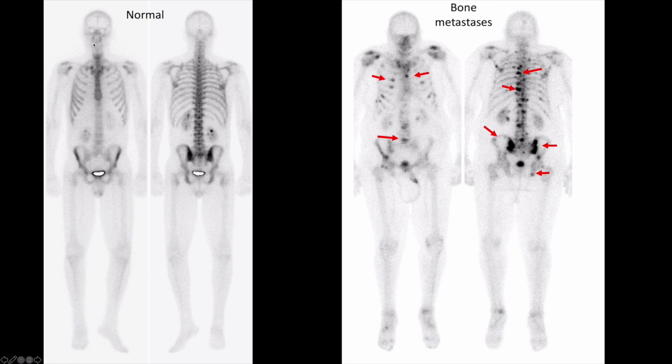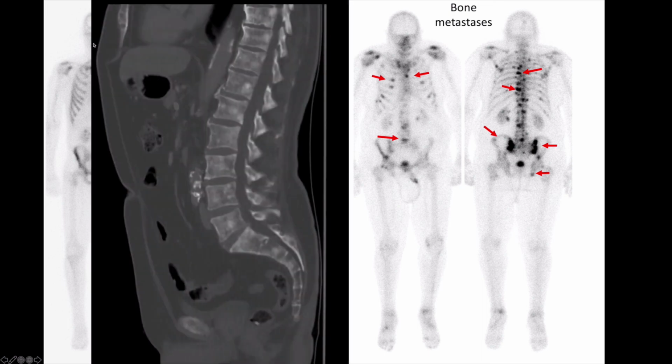One of the limitations of conventional nuclear medicine, however, is that while it is quite sensitive, it sometimes isn't very specific. As we mentioned, there are several other things that can also cause increased uptake on a bone scan, not just metastases, but potentially fractures and degenerative changes. Obviously, the distribution of uptake on this is more typical of bone metastases, but you would still want to correlate with other conventional imaging, such as a CT scan, to make sure that indeed we are seeing metastases or not.